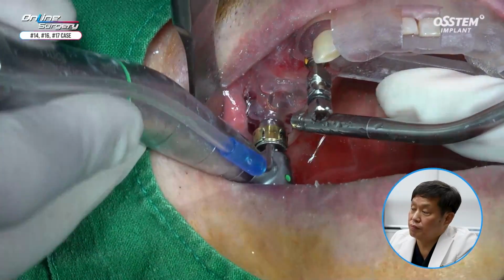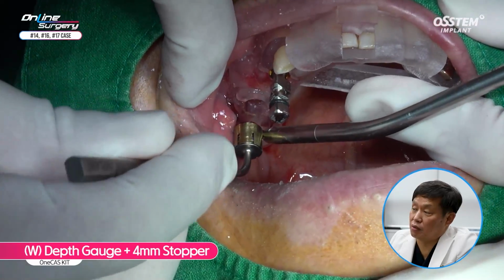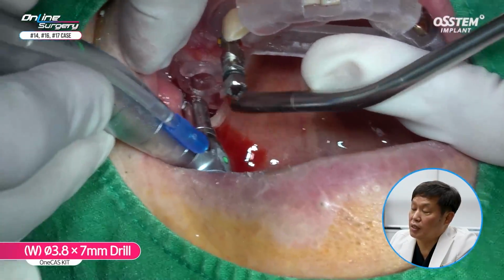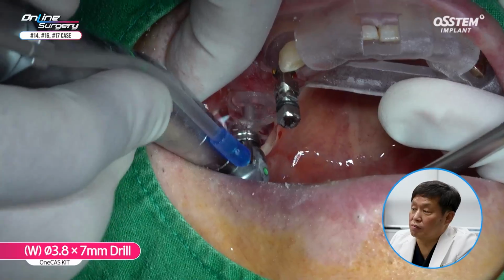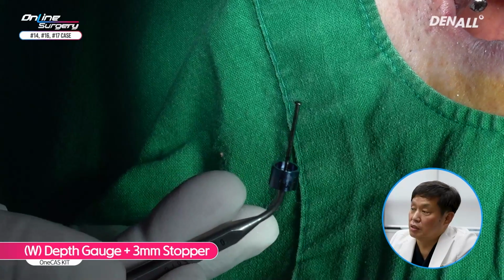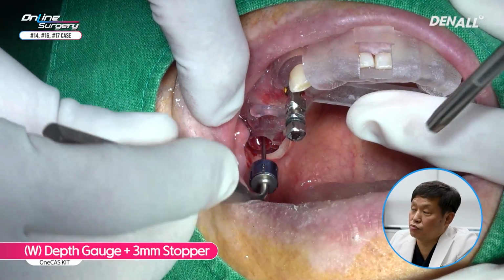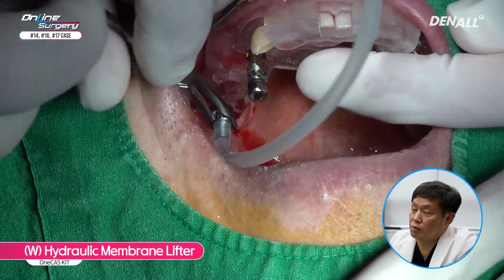In order to check whether the sinus floor has been penetrated, 4 millimeter stopper was used on depth gauge. Depth gauge is not fully going in, so sinus floor was not fully penetrated. 7 millimeter drilling was done without stopper. Drilling was done up to 7 millimeters. 3 millimeter stopper was used on depth gauge. You can see that it's going in sufficiently and there's contact. So sufficient sinus floor penetration was done and hydraulic lift ensued.